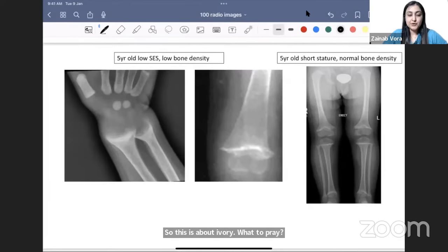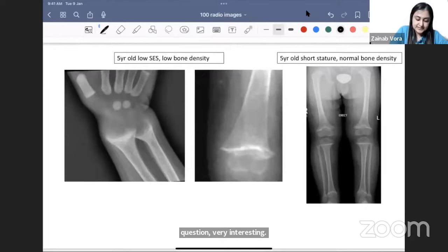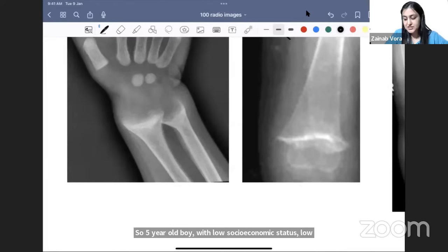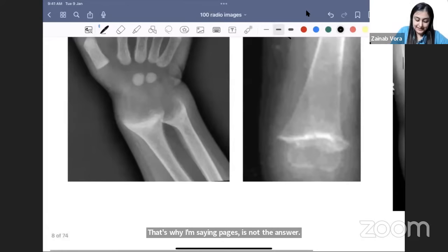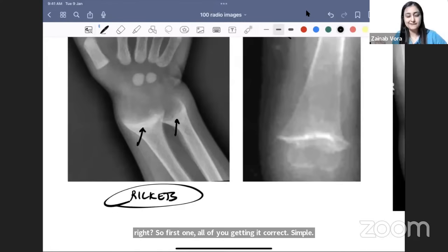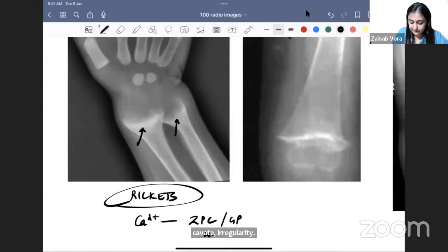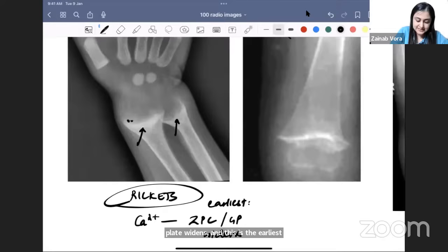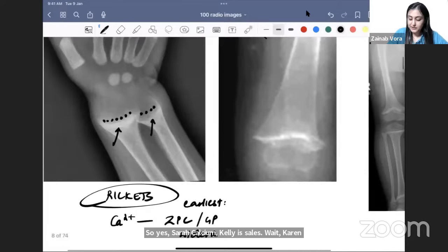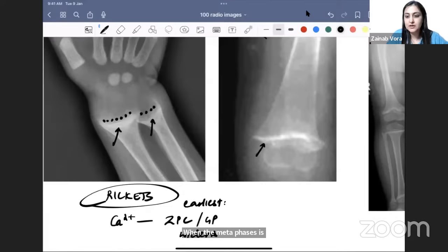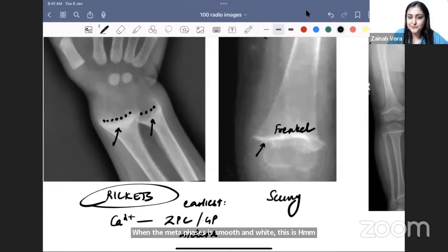Next: a five-year-old boy with low socioeconomic status and low bone density — two scenarios. First, all of you are getting it correct: metaphyseal cupping, splaying, and fraying — widening of the metaphysis with irregularity because there is no calcium. The zone of provisional calcification in the growth plate widens — this is the earliest sign of rickets, as cells wait for calcium and compress on the metaphysis.